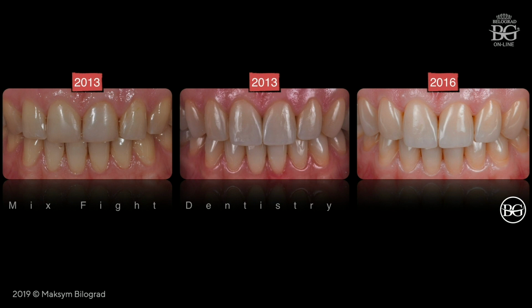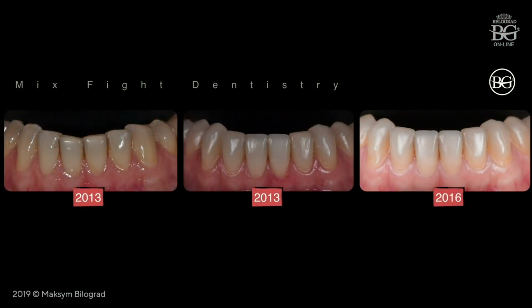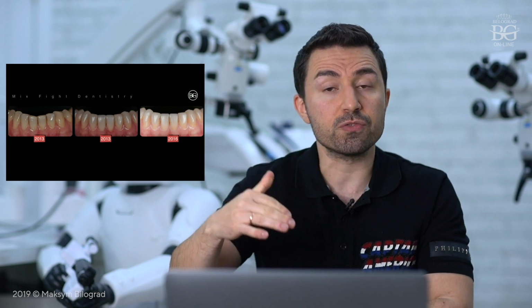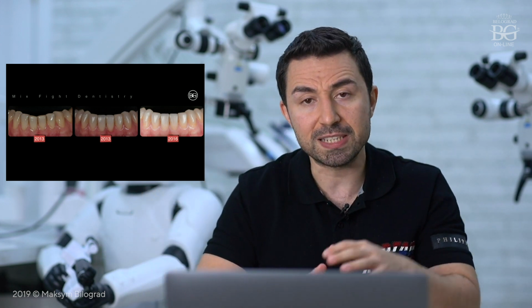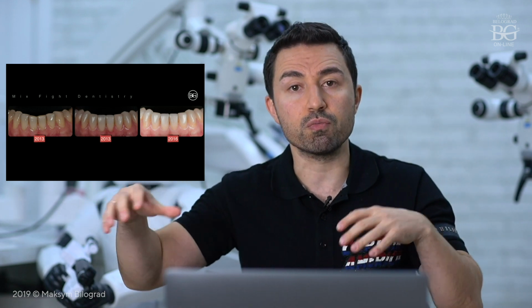This is her decision. Anyways, this is the result you can see from the frontal area from 2013, before, after, and after 3 years. Pretty good result, as I mentioned, as well as the lower jaw, and some summary about this case. So this case was driven by aesthetic treatment planning, and then aesthetic treatment planning was transferred into occlusal treatment planning. So aesthetic parameters were used as the core base to restore occlusion.